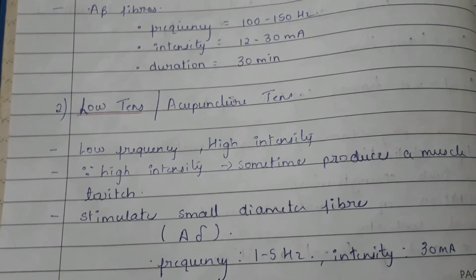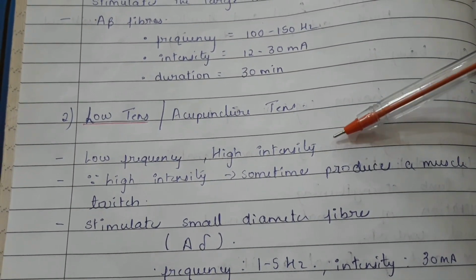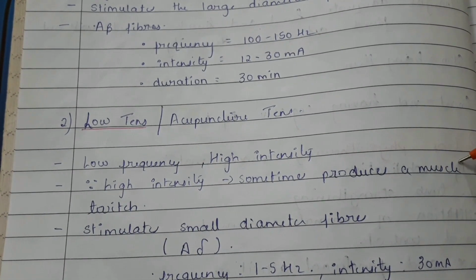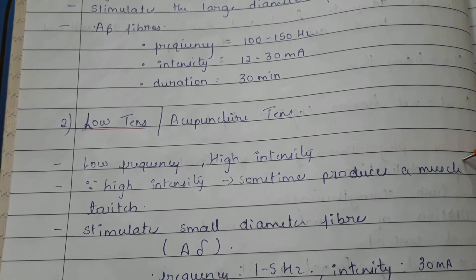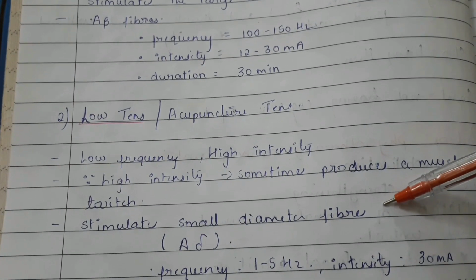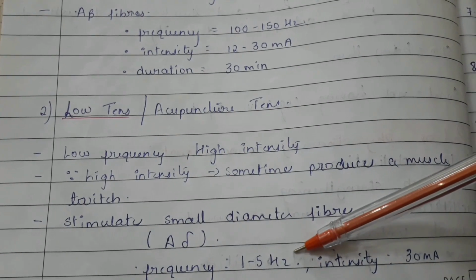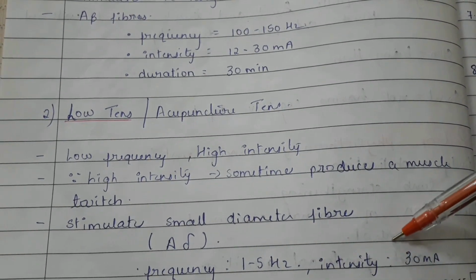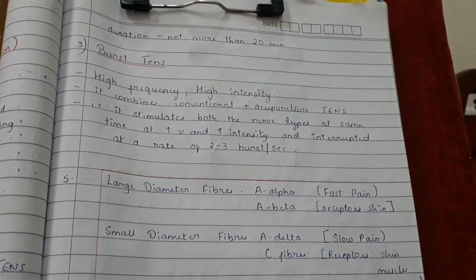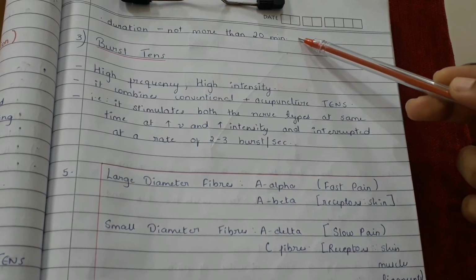Next we have the low TENS, also called the acupuncture TENS. It comprises low frequency and high intensity. Since it is high intensity, sometimes it might produce a muscle twitch. It stimulates the small diameter fibers, that is the A delta fibers. Frequency used here is 1 to 5 Hz and intensity is around 30 milliampere. And duration for low TENS is not more than 20 minutes.